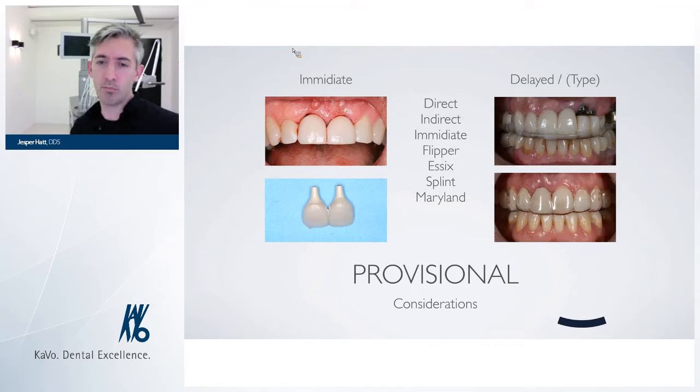I really don't use Maryland bridges that much because I think it's a mess to take them off and put them on during surgery. With all the blood, the healing might be compromised because of the composite components. So usually I try to avoid it, but we still use it sometimes.